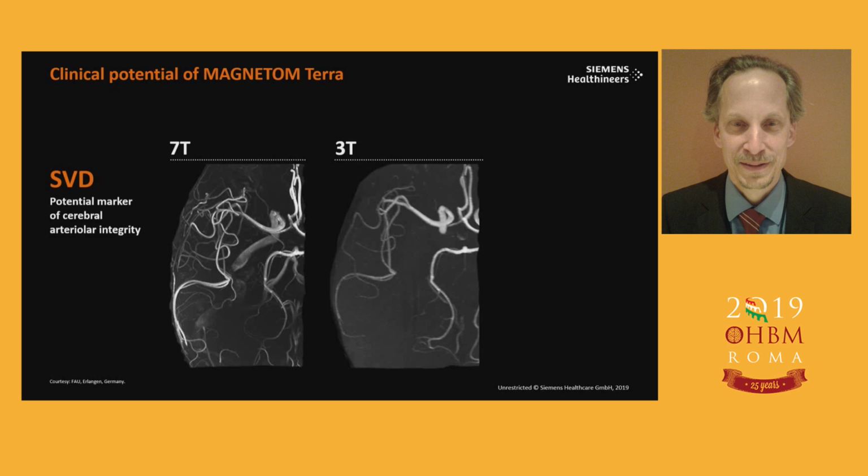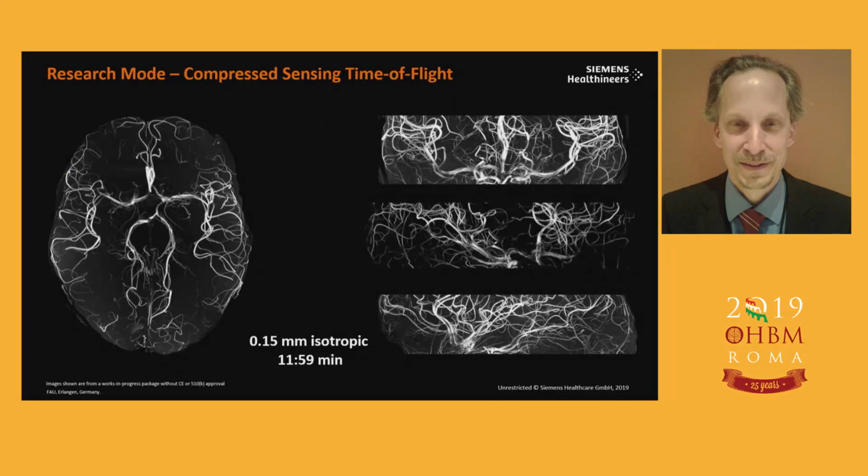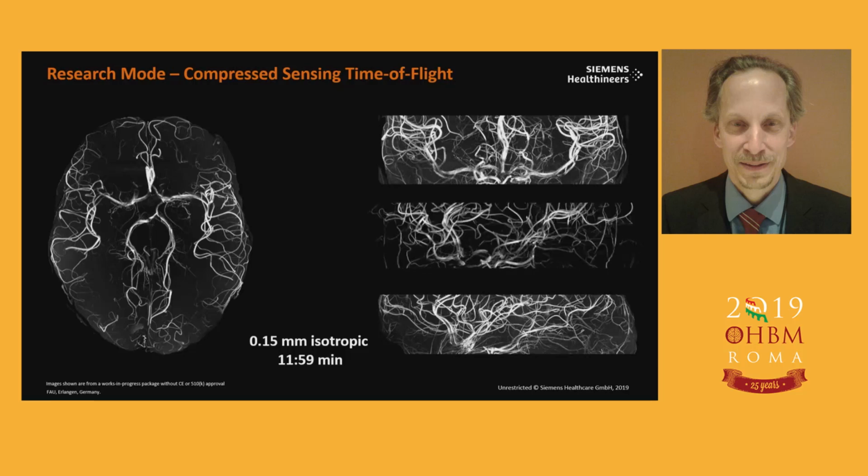And it's very obvious that 7T here outperforms 3T, and most people agree that this kind of resolution is only possible with contrast agent at 3T, not without. So again, this is time of flight, so no contrast agent.